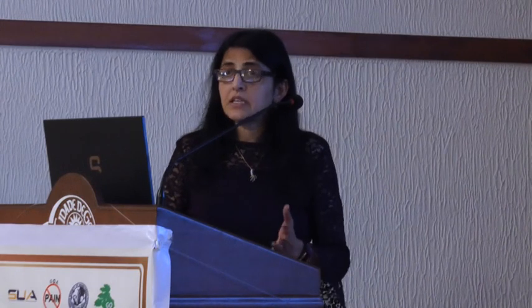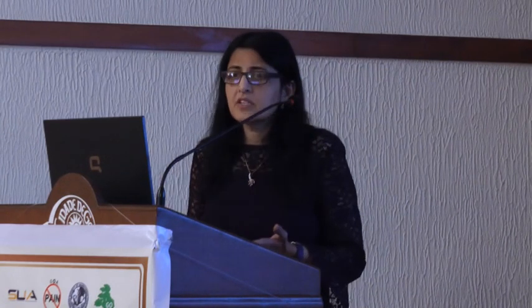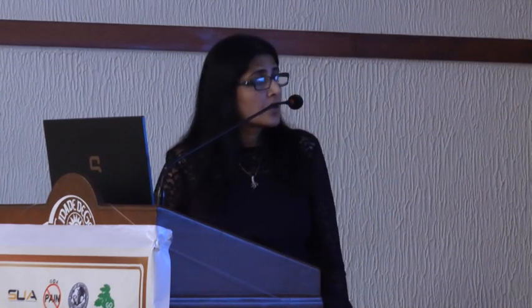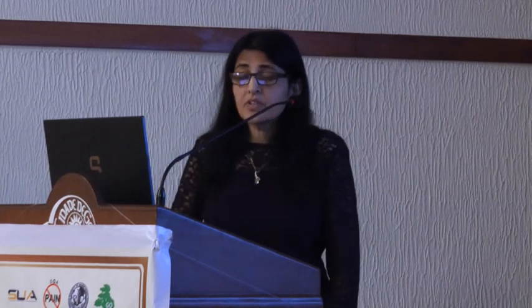The brachial plexus in the supraclavicular region and in the interscalene region is very superficial, about 1 to 3 centimeters at the most. So maintain a shallow trajectory of the needle to avoid interfering with the dome of the pleura, or if you're too deep, you can actually do an intrathecal or epidural injection with the interscalene approach. Try and avoid the phrenic nerve. I mean, you can't avoid the phrenic nerve blockade with the interscalene approach, but at least you can avoid damaging the phrenic nerve.